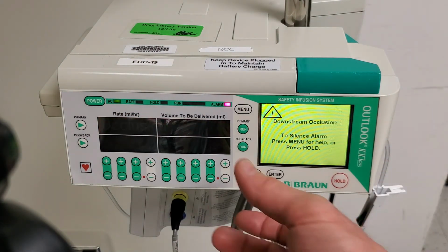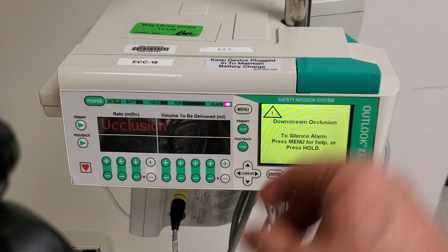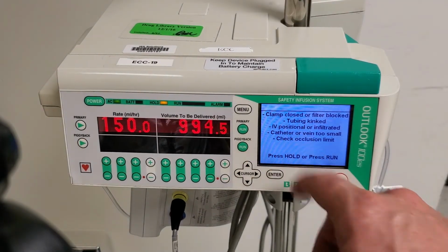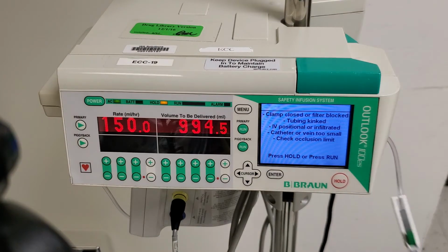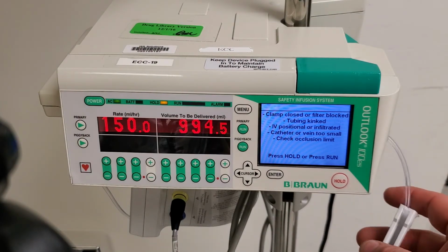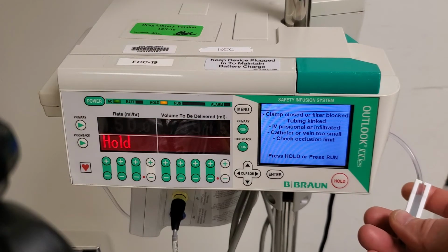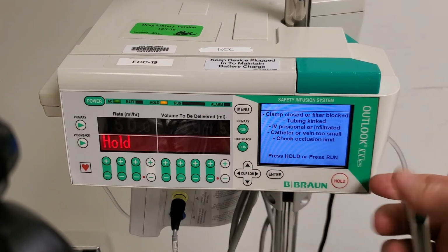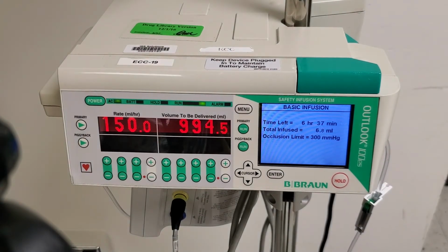So on this error, if we hit menu to silence the alarm, it says to silence the alarm, press menu for help or press hold. So if we press menu to silence the alarm, it gives us options to troubleshoot. Clamp closed or filter blocked. Okay, check those. Tube kinked. Check for that. IV positional or infiltrated. Check the patient. Make sure you have a right size catheter, and check the occlusion limit. In this case, it's the roller ball. So we'll open that and we'll press run, and now we're pumping again.